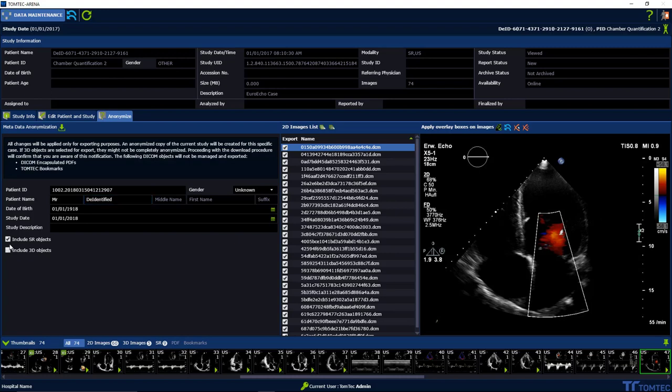Exclude 2D images from export by unchecking from 2D image list. Please see on the right, you can choose or unchoose all.